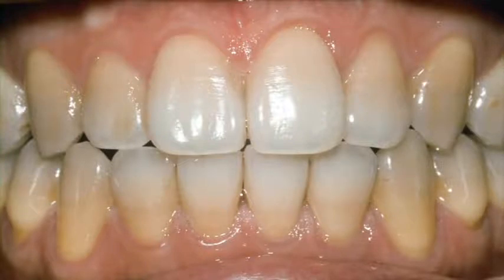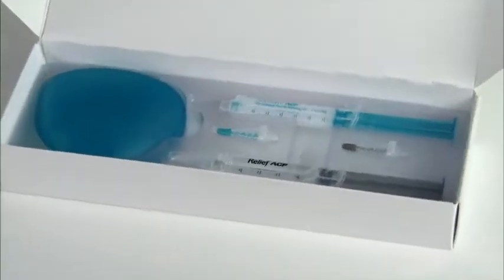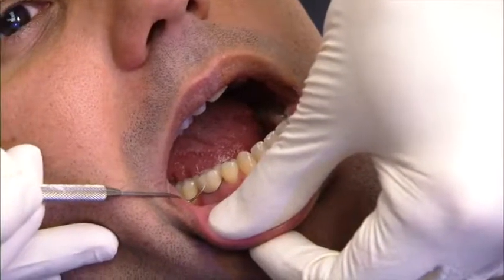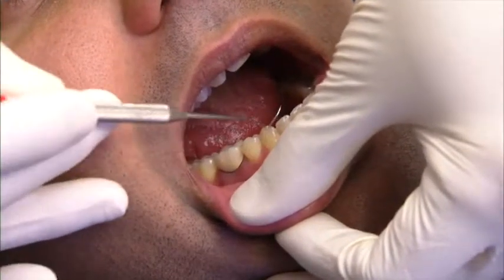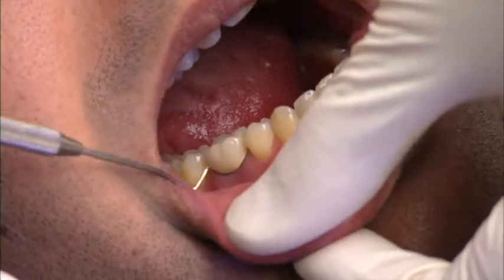Patients with severe gray, tetracycline, and/or fluorosis staining will require additional follow-up take-home or further in-office treatment. These patients may experience less dramatic results, but should experience an improvement. Crowns and other tooth-colored restorations will not whiten. To maintain uniform color, tooth-colored restorations may require replacement following whitening.